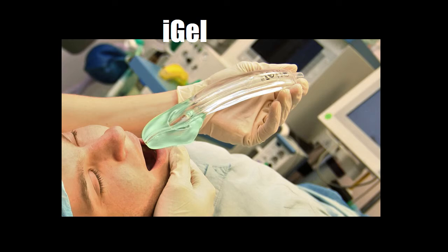You put that on a tongue depressor, and you have a mil or two, and you just run it along the back of the tongue very gently and allow it to melt down the back of the tongue to essentially coat the supraglottic area and the piriform fossa either side of the airway and onto the airway, because that's often the most stimulating part when you're doing laryngoscopy. And even with that precision laryngoscopy, you're still going to need a little bit of lift at that stage when you get the tip of the laryngoscope into the vallecula.